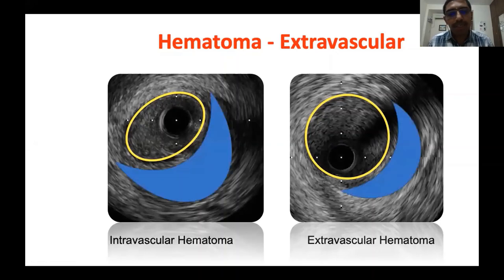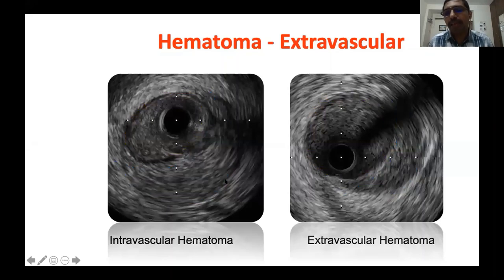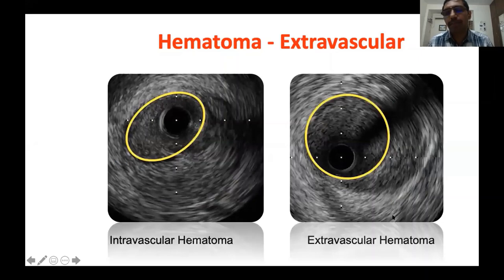Here is the lumen and blood in the intravascular space — that is intramural hematoma. Here is an example of extravascular hematoma: this is your lumen, this is your vessel architecture, there is a breach in the architecture, and blood accumulates in the peri-adventitial space — that is your extravascular hematoma.